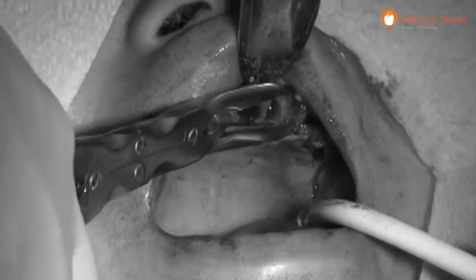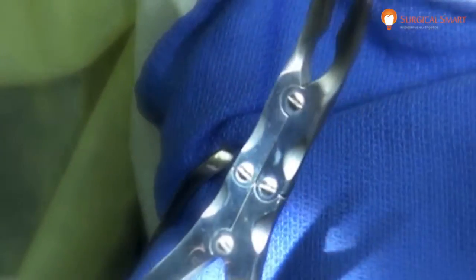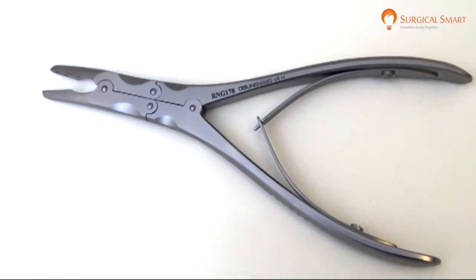The effortless nature of this tool during bone removal allows the doctor to have far less physical stress during surgery, and its efficiency will decrease the time required for bone collection.